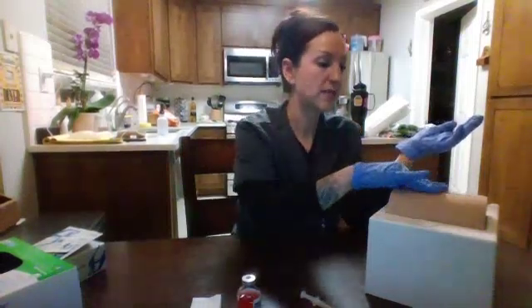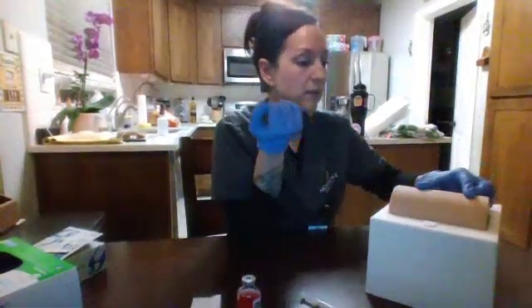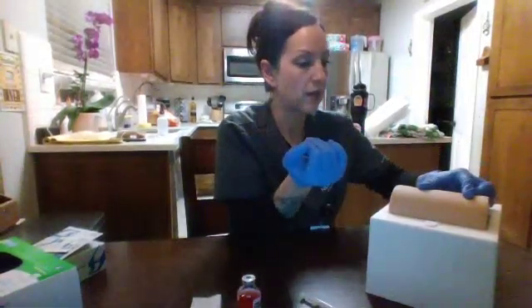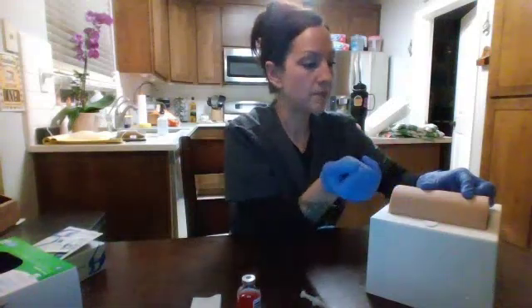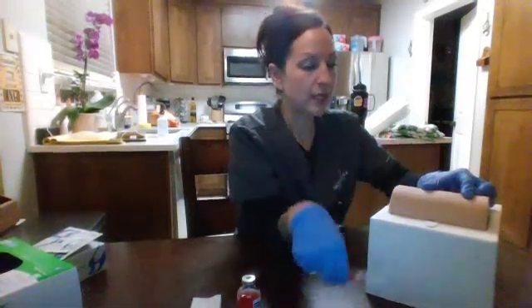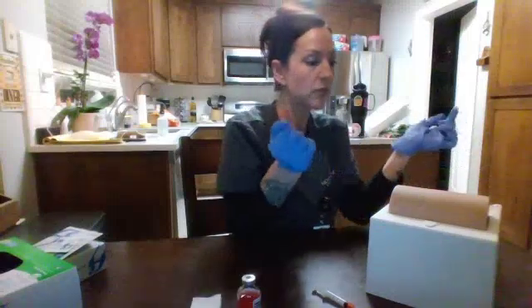I'm going to feel for any tenderness or masses. I'm going to grasp the skin with my thumb and forefinger and measure the skin fold from the top to the bottom and make sure that the length of the needle is half of the length of this skin fold here. Now I'm going to clean the area.